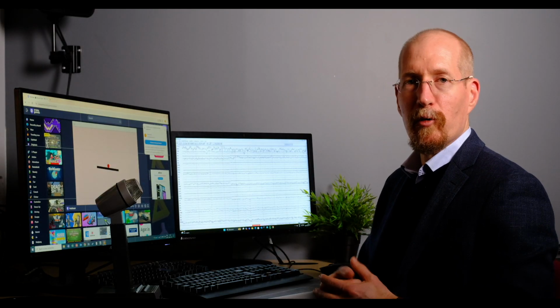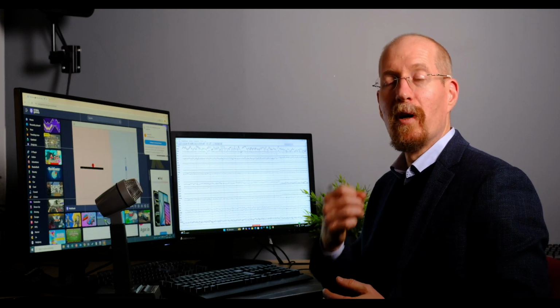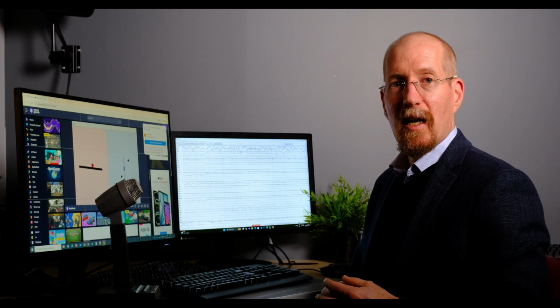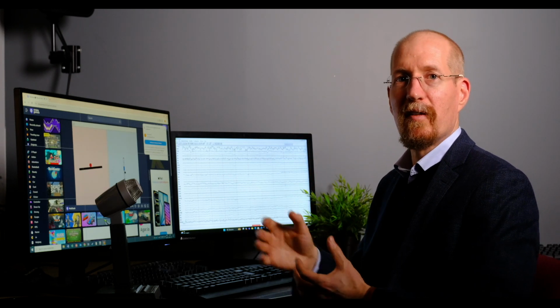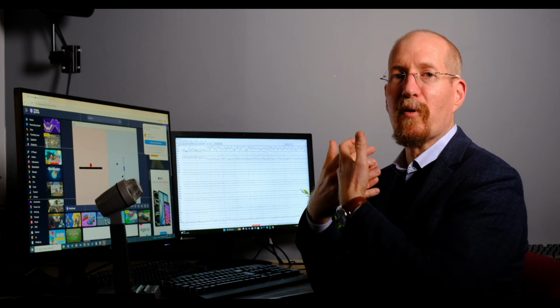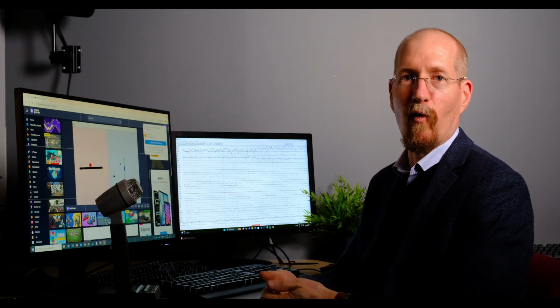Being able to have multiple trials of a task is very helpful because you never know what sort of noise artifacts might be present in any given trial. The more trials you have, the more you can average out that random noise and be left with the actual neurophysiological signal that is representative of the cognitive state required for performing that task.